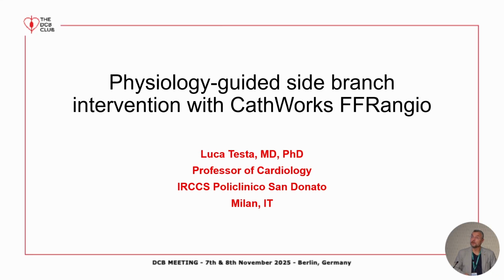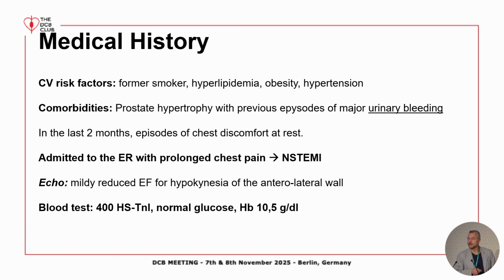Good morning, and thanks for the opportunity to discuss this relatively new technology that, to be honest, and let me disclose this, took almost a year to convince me about the opportunity of using it regularly in the cath lab. Now, I'll try to show you just an example, because honestly, I changed my presentation this morning. I took off all the slides related to the physiology for bifurcation, all the discussions that we've done over the last day and a half. So I said, okay, let's start from the case and see what you think.